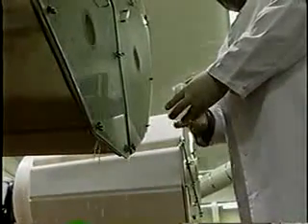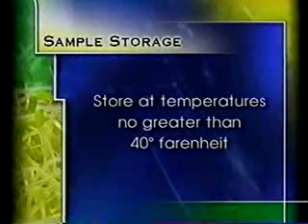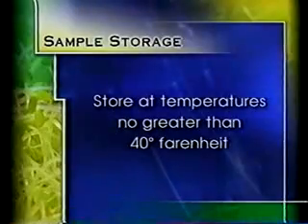Samples should be delivered to the laboratory promptly and not held for any length of time before analysis. Preferably, samples should be stored at temperatures no greater than 40 degrees Fahrenheit if analyses cannot be performed within the first 2 hours after sampling. A sample of spent irrigation water should be collected for each production lot or batch. At least 1 liter of spent irrigation water should be taken as the water leaves the drum or trays during the irrigation cycle.